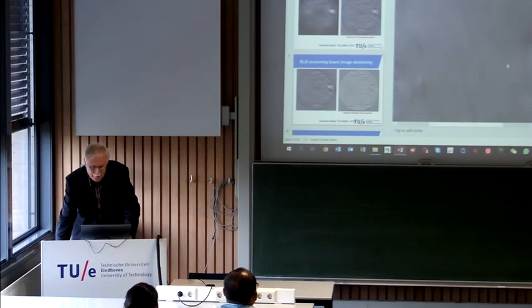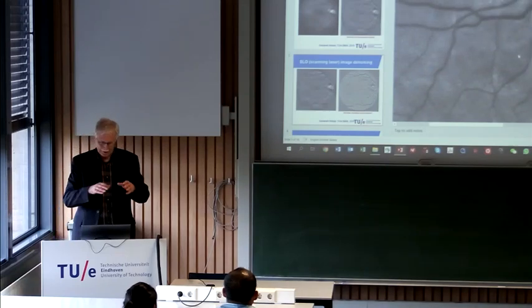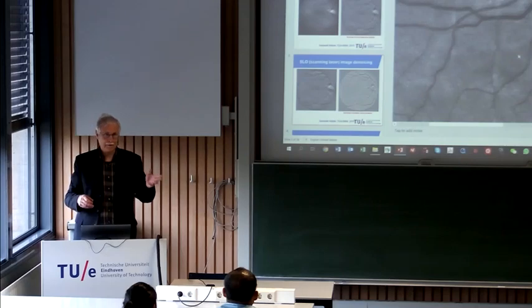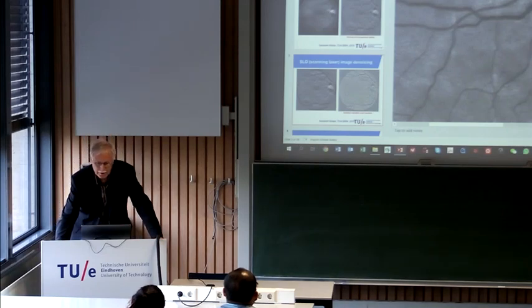It's quite amazing. But the laser scan has the advantage that there is very much contrast because it is absorbing in the hemoglobin, as I said, 531 nanometers. So the contrast is higher, but the resolution is lower, but that pays off. You also see very nicely the difference here. This is an artery with reflections, and this is a vein. It's thicker and it's darker.